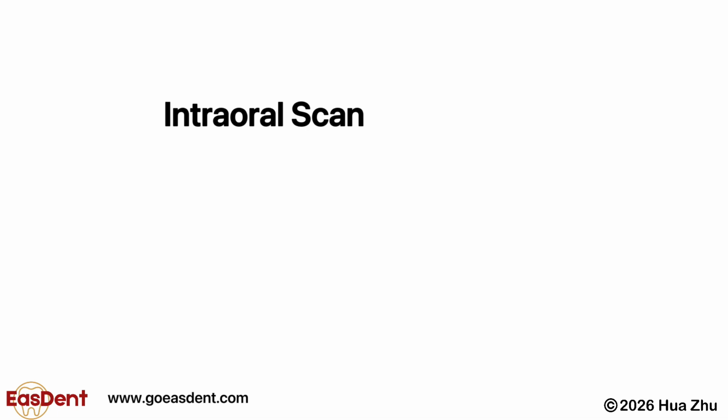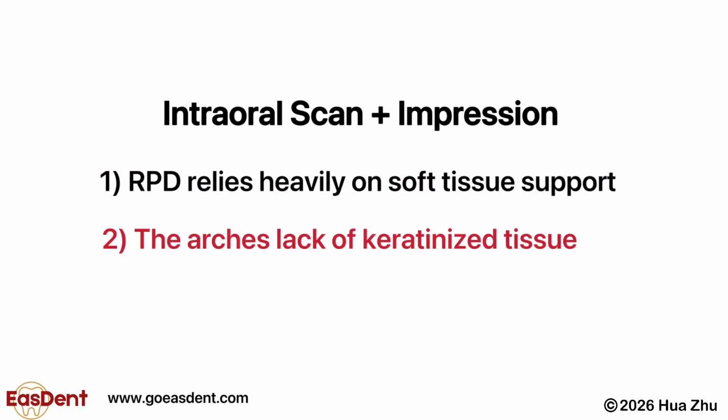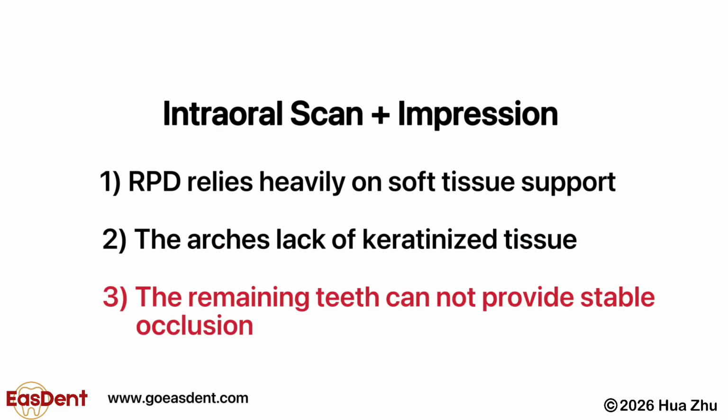When intraoral scan alone is not enough, we need to add impression. This pathway is recommended when the RPD relies heavily on soft tissue support and accurate functional borders are essential, or the arch lacks sufficient keratinized tissue and the non-keratinized tissue cannot be reliably captured by intraoral scan alone, or the patient does not have enough remaining teeth to maintain a stable occlusal relationship, requiring a wax rim to record the bite.